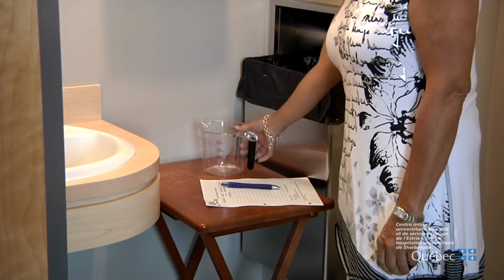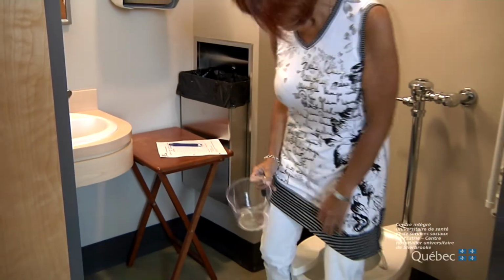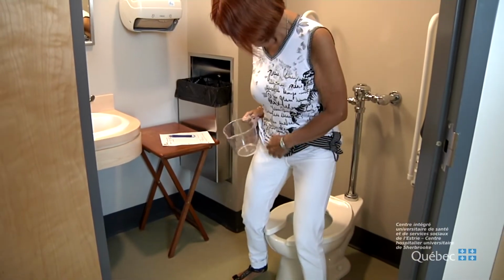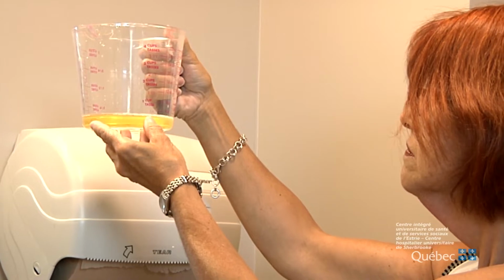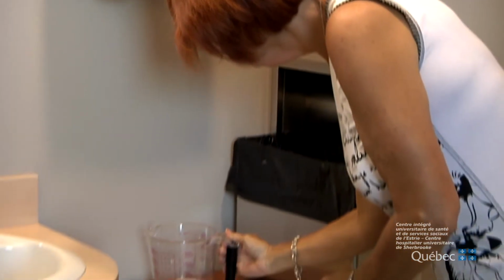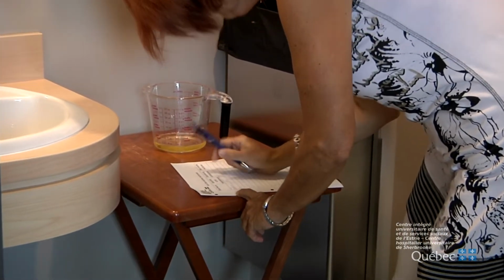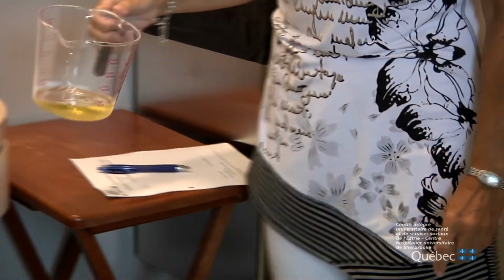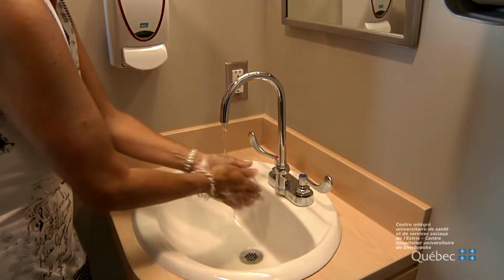First, you need to try to urinate normally and collect the urine produced. You'll need a measuring cup. Sit on the toilet, position the measuring cup to collect your urine and urinate. After you have finished, measure the volume of urine in the cup in milliliters. Record the amount on your sheet. Dispose of the urine in the toilet and wash your hands.